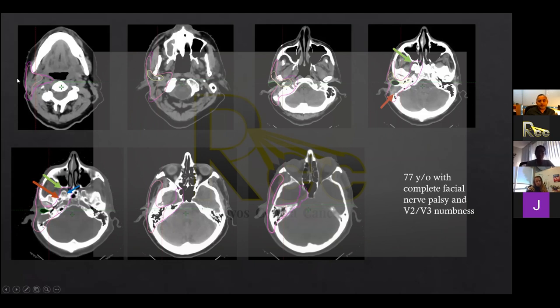So the patient underwent a parotidectomy, was noted to have a tumor there. And then basically here you can see us radiating the resection bed. So you can see what these volumes look like in here. Up here you can see covering the stylomastoid foramen, and then you can see that the patient had surgery here in the petrous portion of the temporal bone. Again, for symmetry, you can see normal anatomy, post-op bed. You can see how we covered that post-op bed basically up here.